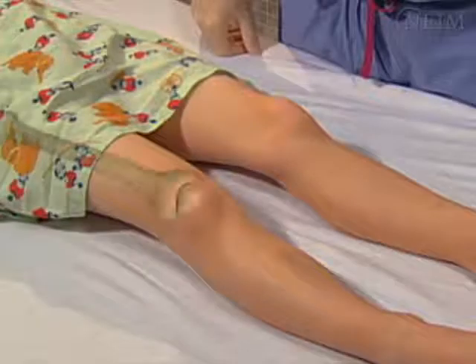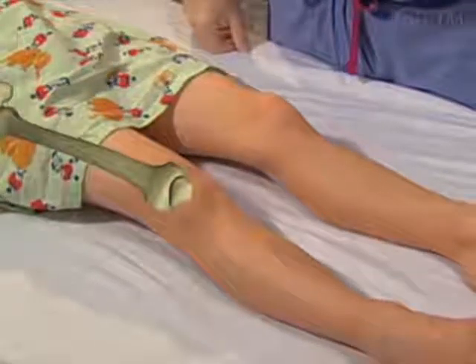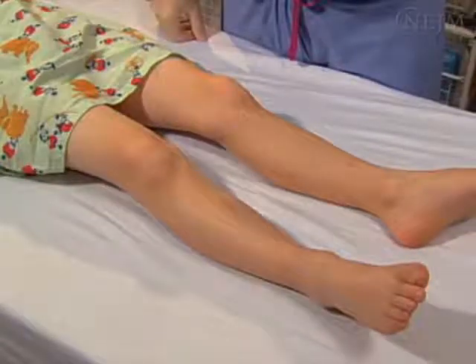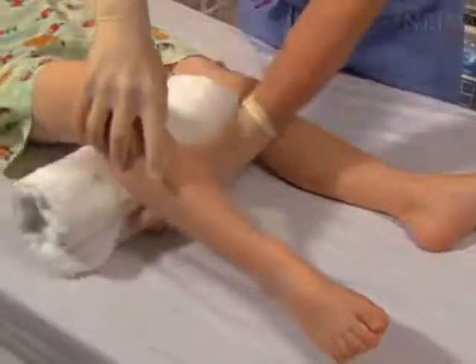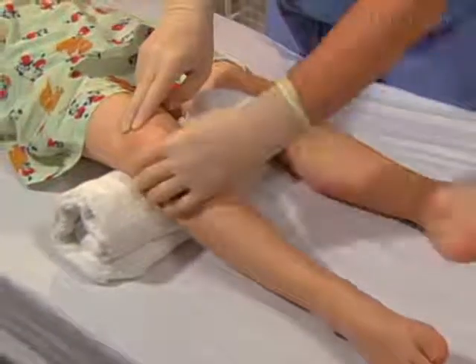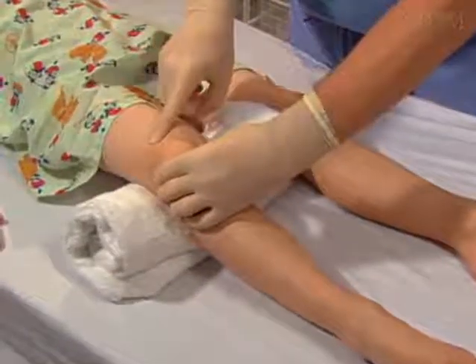The distal femur can be cannulated for intraosseous infusion, though abundant overlying soft tissue and muscle often make identification of bony landmarks challenging. Therefore, this site should be considered when the use of tibial and humeral sites is contraindicated. To relax the quadriceps, flex the hip and knee slightly with a towel roll. The distal femoral insertion site is in the midline, just 1 to 3 centimeters proximal to the palpable epicondyles of the distal femur.